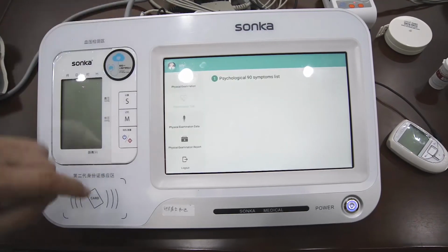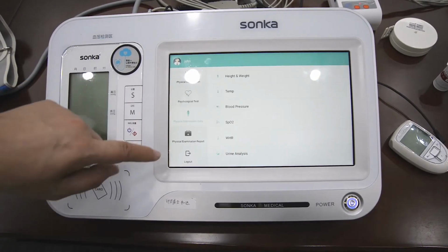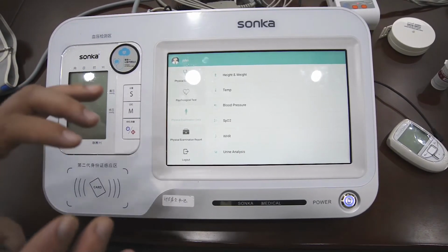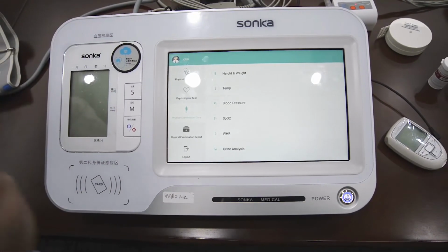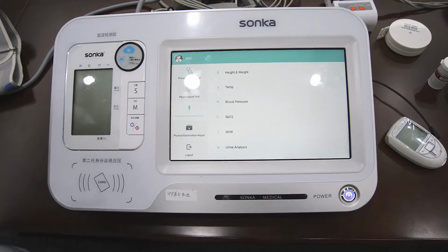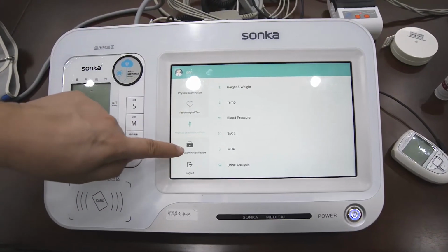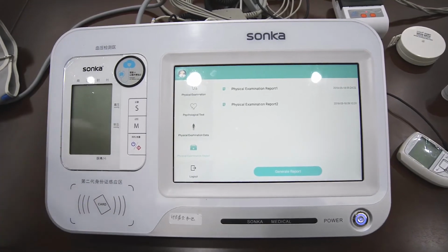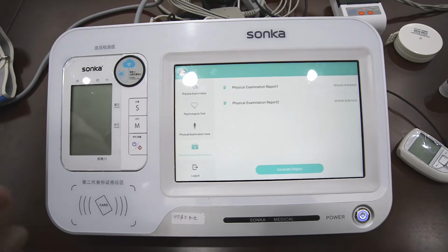Okay. For this one, we go to the history report. The doctor can check the patient's history, what his data was in previous tests. And next one, this is a report. The doctor can have the report of each patient.